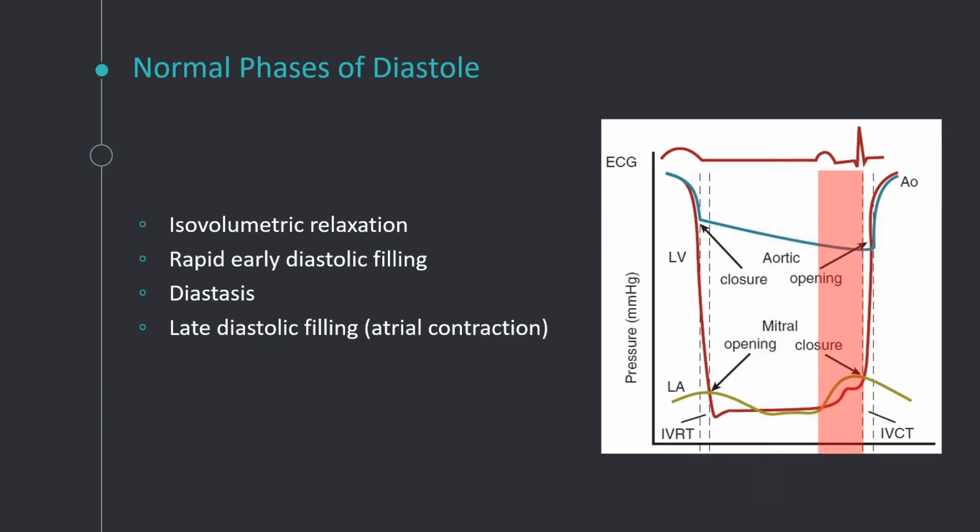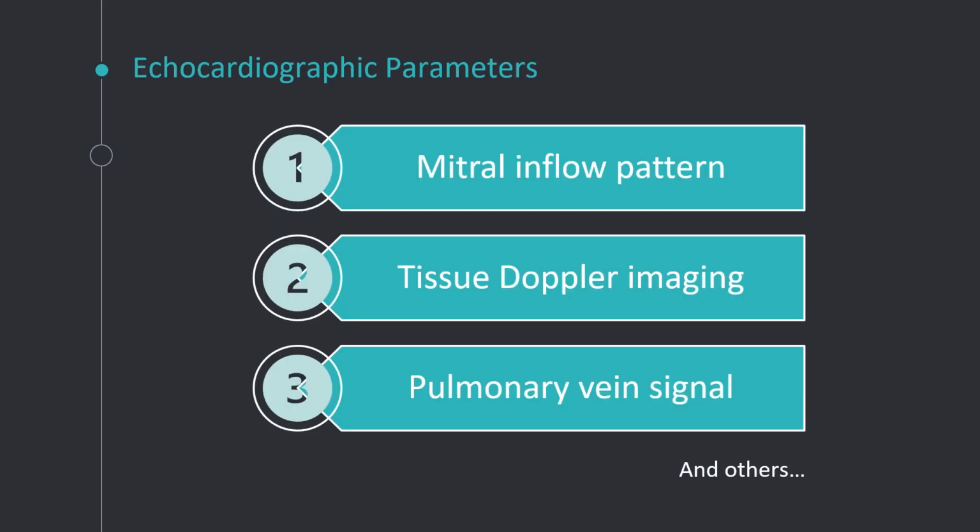And at the end of diastole, we have the late diastolic filling. It's more of an active filling, mostly driven by atrial kick, an atrial contraction. As you can see on the surface ECG, you have a P wave and the atrial depolarization as well. So you have an extra kick that heightens the LA pressure, and now you have that LA and LV pressure gradient again. So you have a bit of flow at the end of diastole, though most of the filling has occurred in early diastole. And then you have the end of diastole, systole starts, and the whole process repeats.